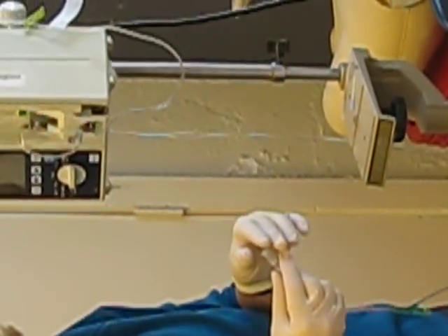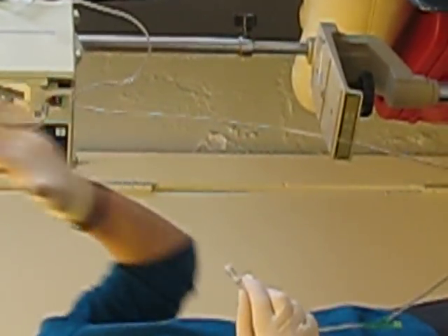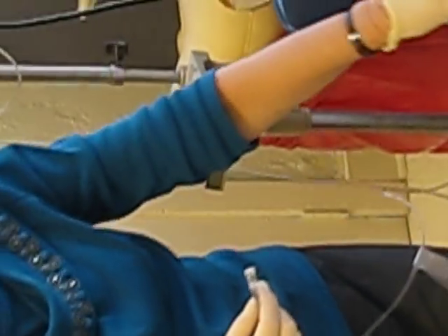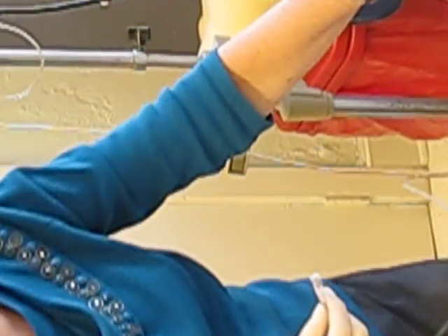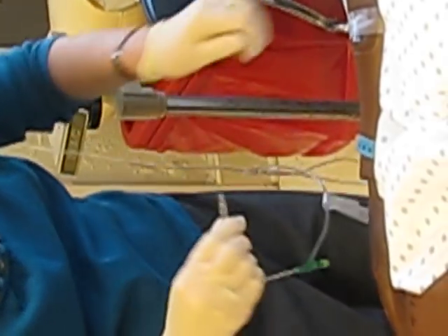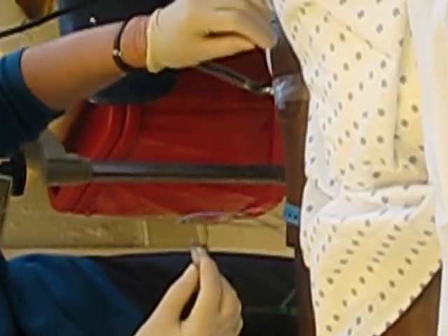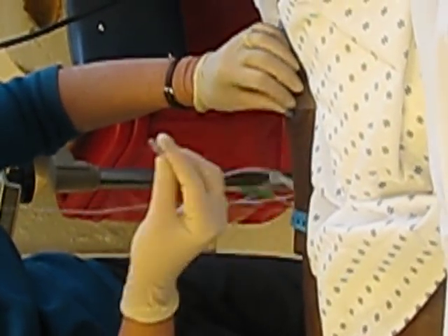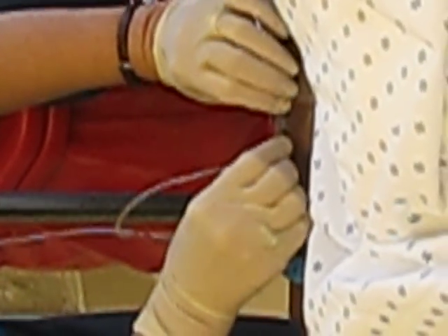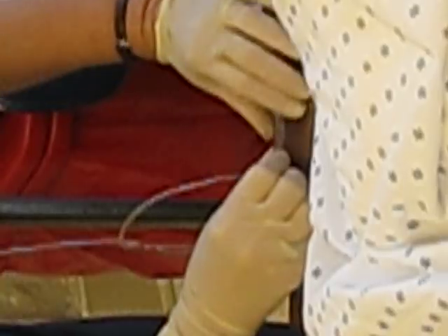I just want to put it there to hold it. We flushed all the air out, and so what we're quickly going to do is change tubing and bag. All of it's set up. We've identified the patient — Mr. Jones, we're going to give you a little extra fluid. The doctor's ordered that for you today. Can you tell me your name? Look at his name band — we know we've got it. So all you're going to do here is take off your cap and place it right into the infusion device.